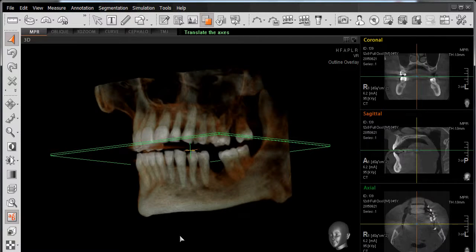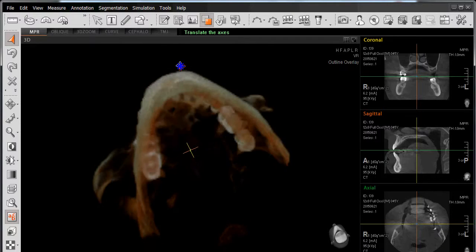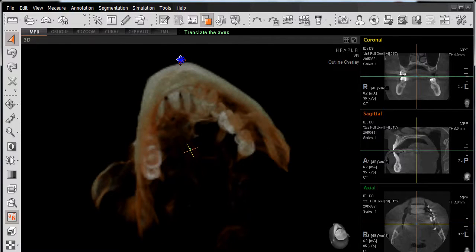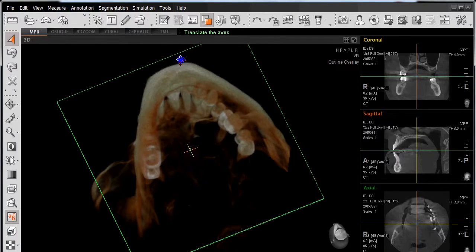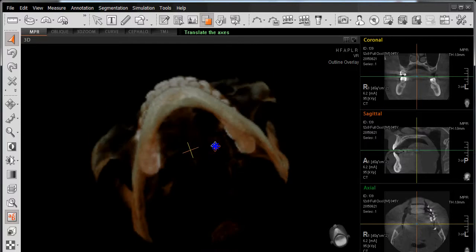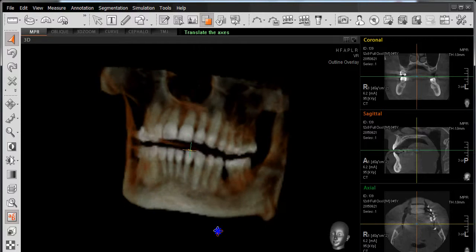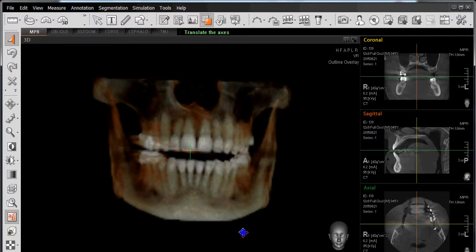If I wish to look from underneath the patient, I can right-click underneath the mandible, go vertical, and now I'm looking from underneath our patient. To rotate back down again, simply right-click again at the top of our window and bring it down towards the bottom.